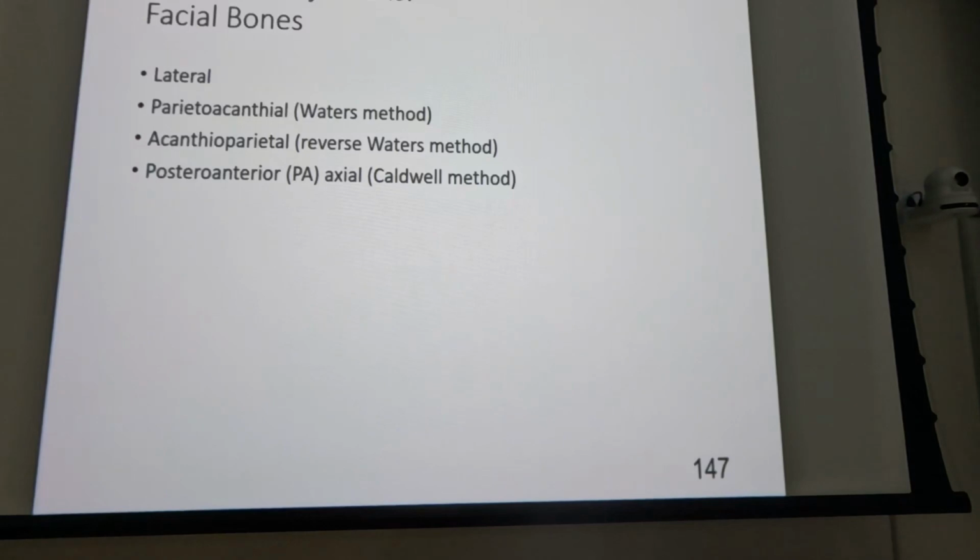Okay, so, and we are going to add one view in here that's not listed here. It's what we refer to as a RESE. A RESE is R-H-E-S-E, RESE. And I think I've got it in the PowerPoints, but it is searchable online if I did not. But I want to describe it and tell you what it is we're looking for.